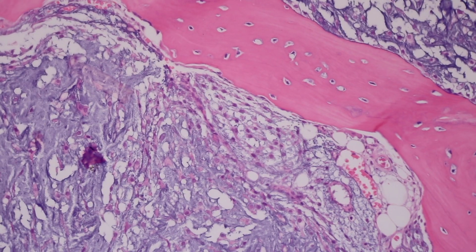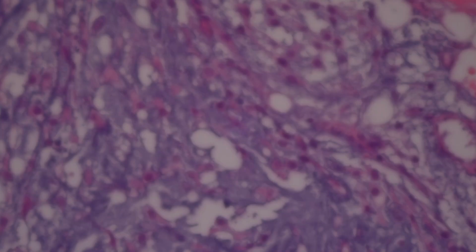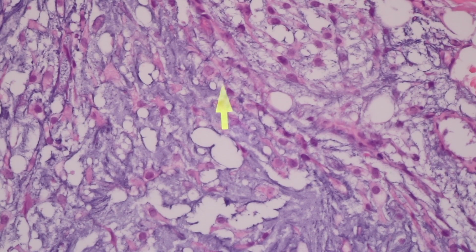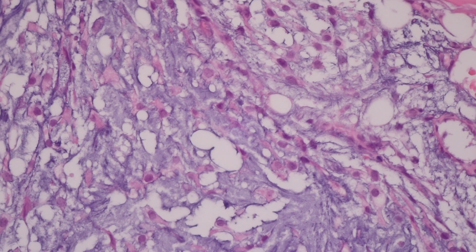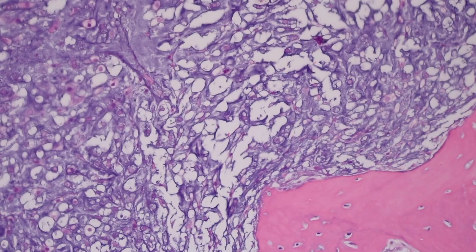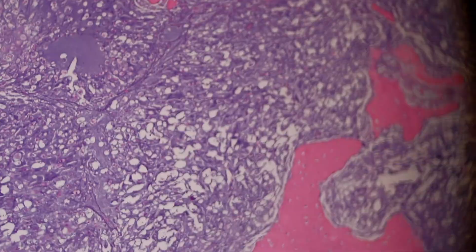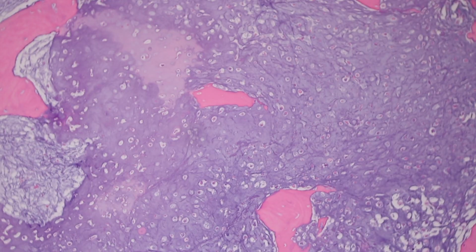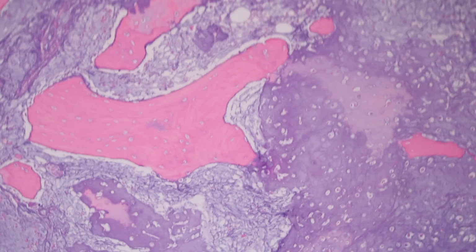And we can see the other things that go along with chondrosarcoma. Increased cellularity. We talked about cytologic atypia in the form of fine chromatin, small nucleoli. I would say that based on the degree of cellularity and atypia, I'd probably call this a grade 2 chondrosarcoma. Grade 2, conventional, predominantly hyaline with some areas that look like it's also myxoid.